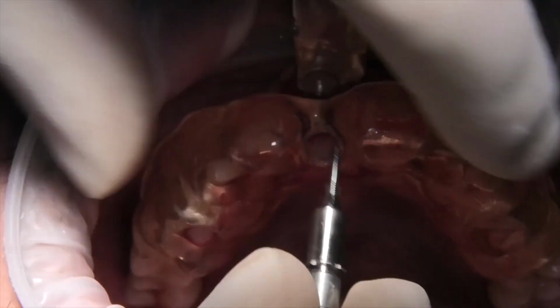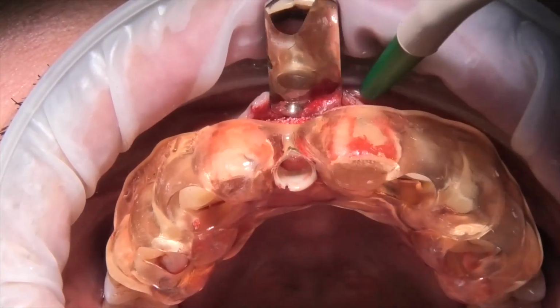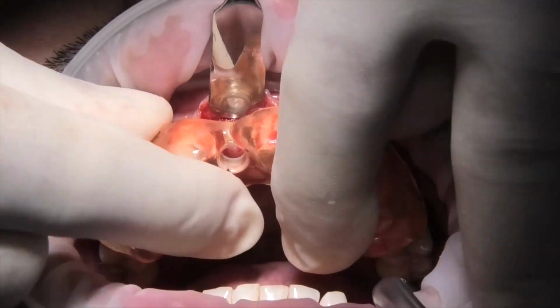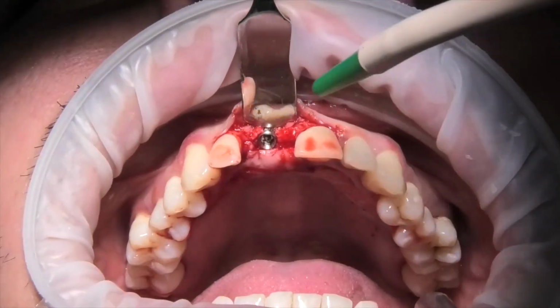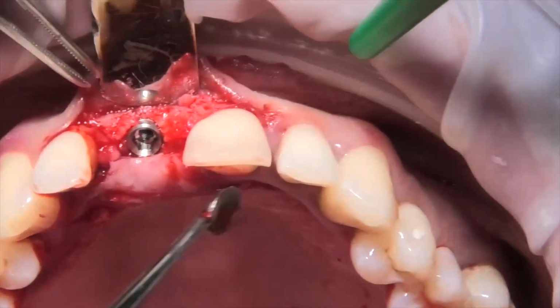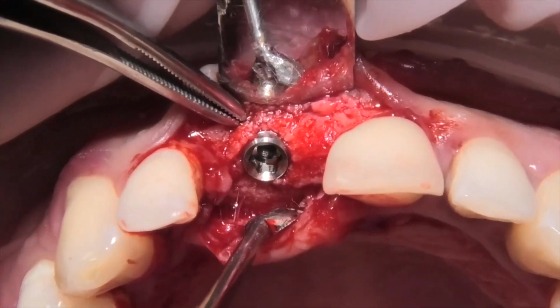At this point, we must make a periosteal incision to free the vestibular flap, to make it slide in the coronal direction and cover the horizontal GBR that we will make and the connective tissue graft that we will place under the flap.